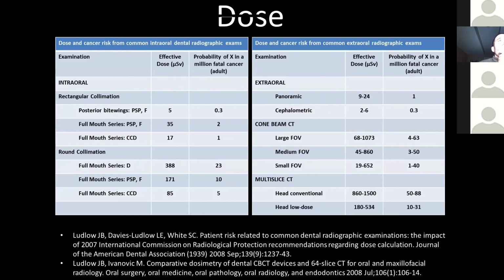Is it reasonable to use cone beam CT as a screening tool without evidence of disease? In other words, in search of occult disease? I think we covered this prior. And again, the answer is really no. We're not screening with this more advanced imaging tool at this time. The yield is not worth the dose.